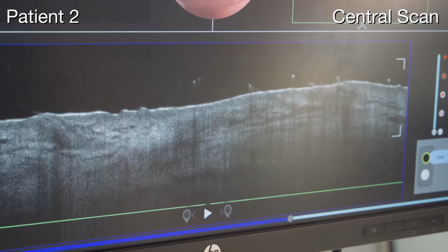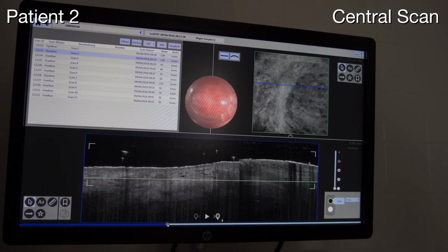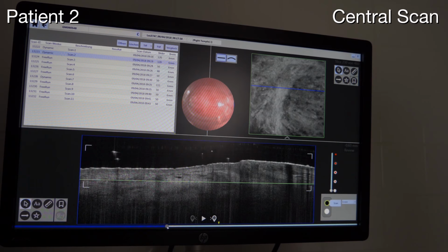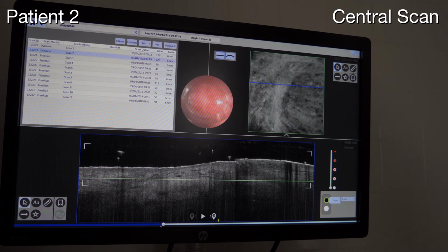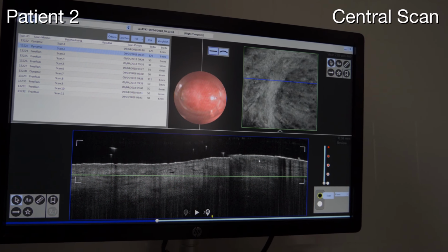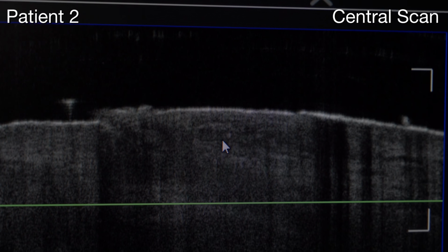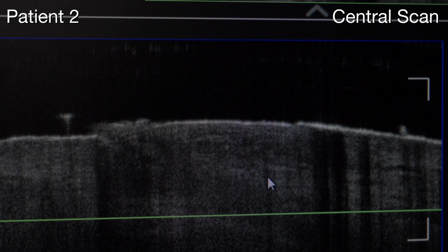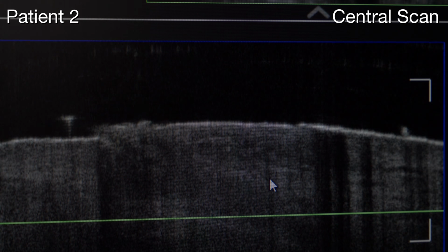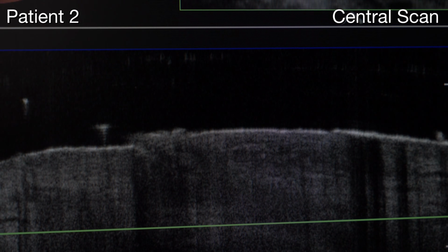And to evaluate, I think here, wait 1 second. This was not so easy because we have a scar and there is no real original tumor left. There are just some residuals. And if we look here, we can imagine that there's some tiny nodule. It was a very small basal carcinoma. We have the histology. It was a nodular superficial subtype basal carcinoma with a tumor thickness of 0.3 millimeters. And we can see some very tiny nodules here.